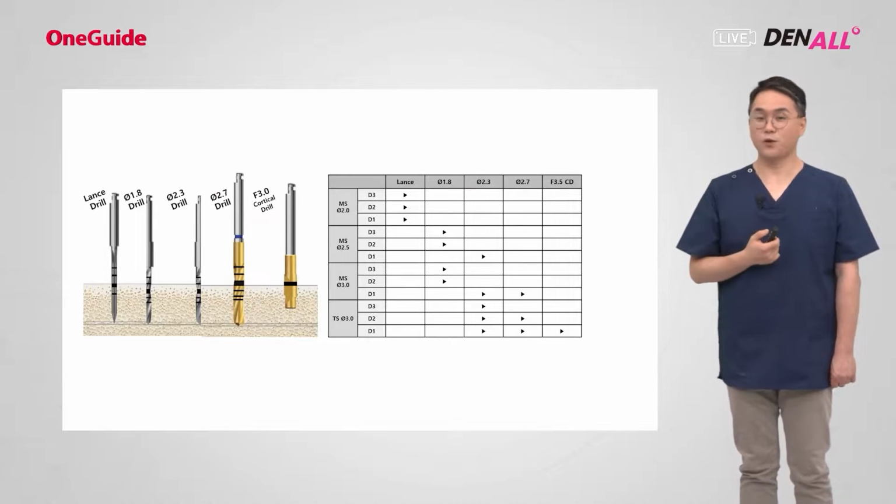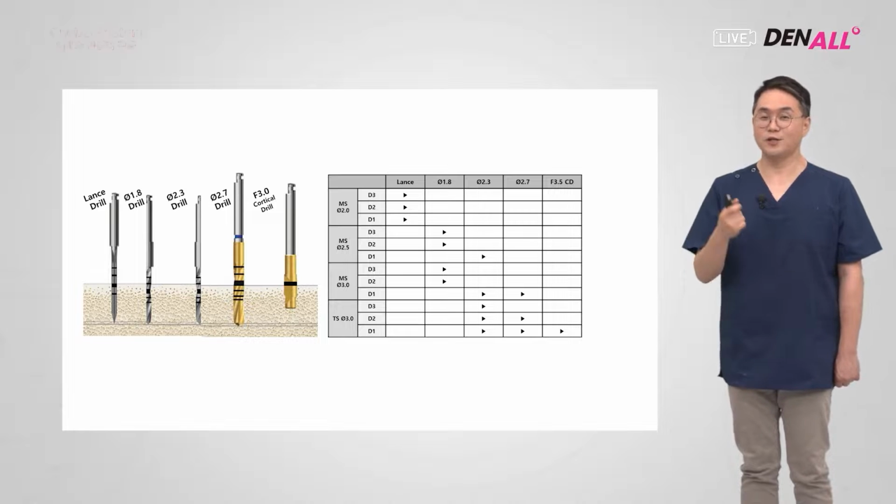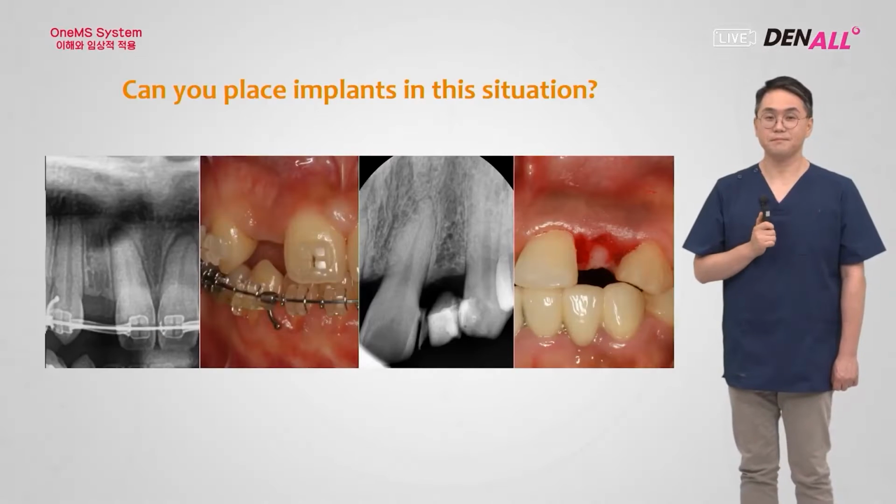So this is the drilling sequence. In most cases, the implant that I want to place, minus 0.7, should be the final drill that you use. So for 2.5, it's 1.8, and for 3.0, you use this type of drill. This is when the bone quality is normal, but on the lower anterior side, D1 or D2 are typical bone quality, so normal drilling procedures are something that you could use.